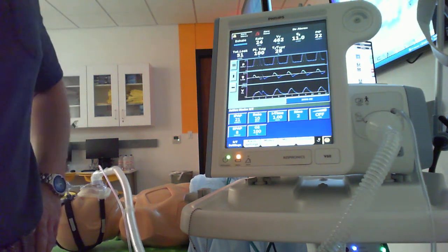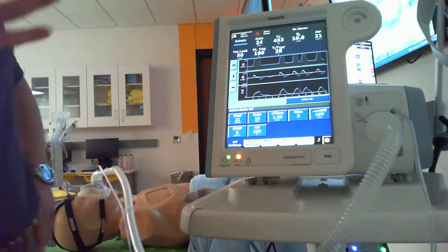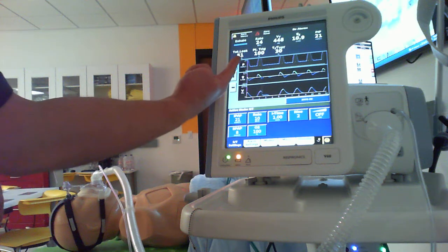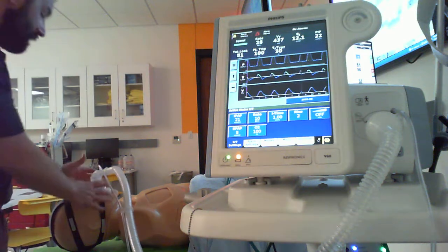And keep in mind, we don't have direct access to their trachea. So if we're pushing air into the mouth and their esophagus opens up, they could get vomit and aspiration. Just to show you again, our leak did go up, all right, by changing these pressures. So once again, I'm still below my 60 goal. If I could get it a little bit more snug, that's great.